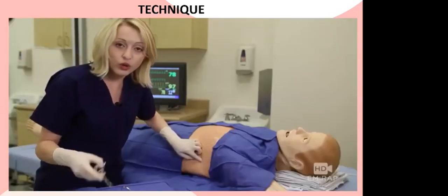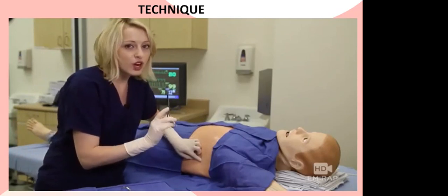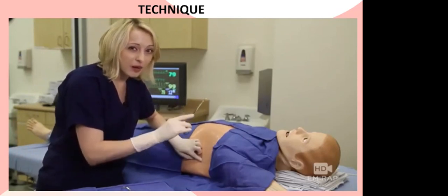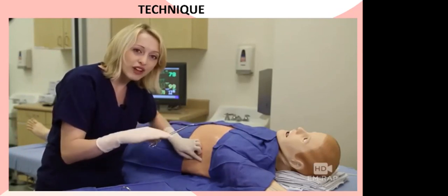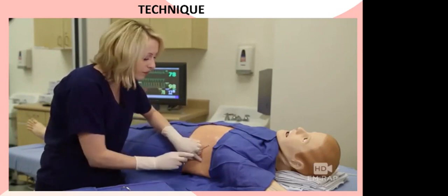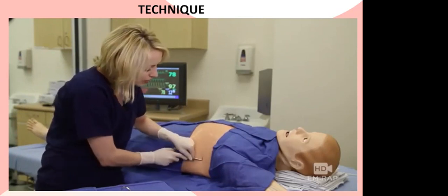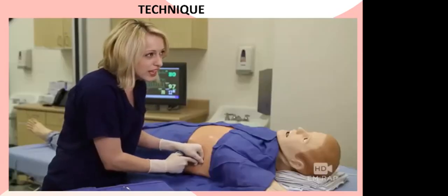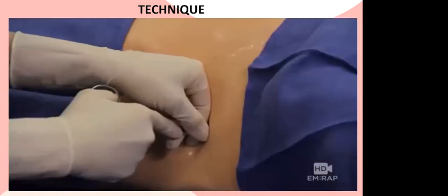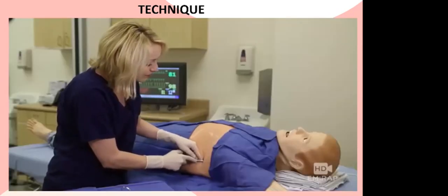And now we're going to bluntly dissect with our Kellys, the small Kellys. Remember, we're going one rib space up because there's a neurovascular bundle that sits at the inferior margin of every rib, and we want to avoid that. Hold the Kellys here so you don't accidentally insert them too far. And insert the Kellys. Now, if you're new at this, it takes more force than you might expect, and it really does feel like a pop. That was it. That's in.